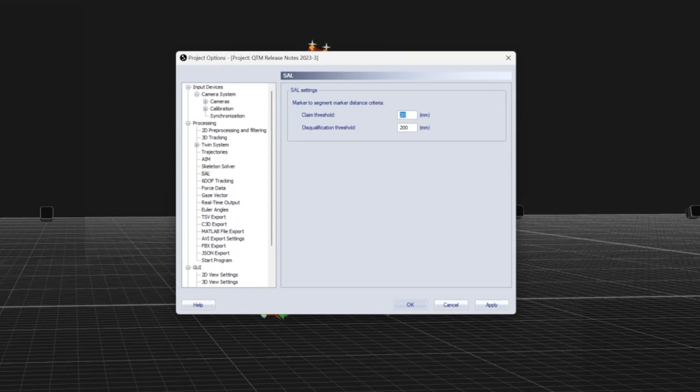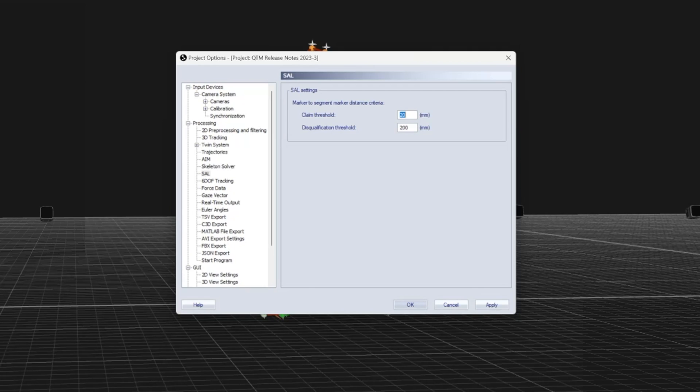The SAL settings page allows you to change the threshold needed for a trajectory part to be considered for a marker and the maximum distance that a part can be before it is disqualified.